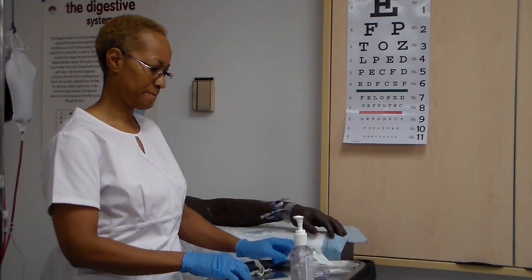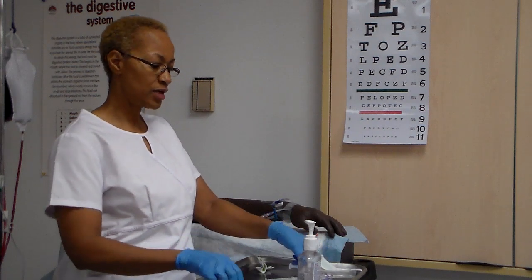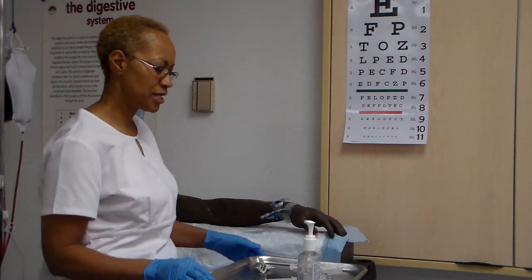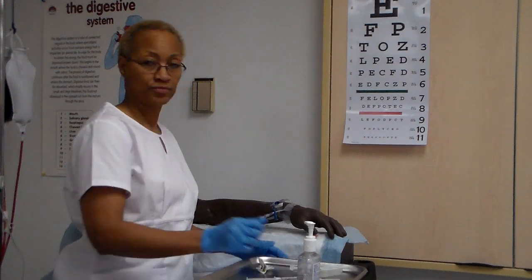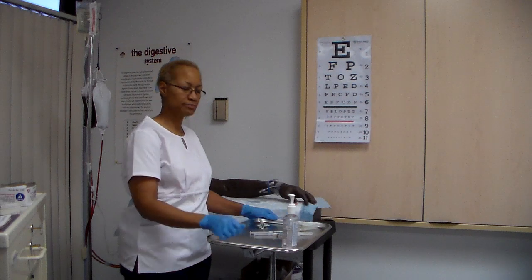Ms. Murray, I have a question. Yes. I noticed that you have several needles on the tray. How can I know what's my med and what's my flush? You would identify it either with tape, you label it, and for me, what happened is my medication was actually yellow. Okay, so I didn't worry about labeling. But you want to get in the habit of always labeling your medication because you may have 2 or 3 clear solutions. And so you want to make sure that you do that.